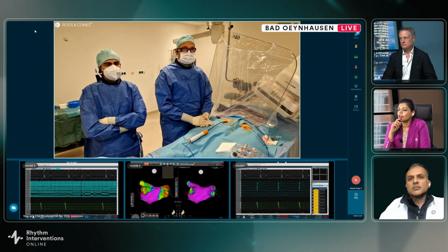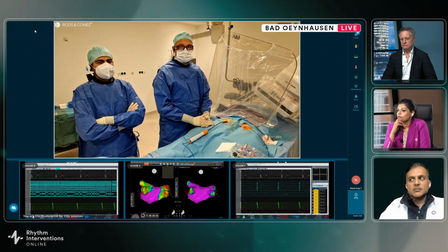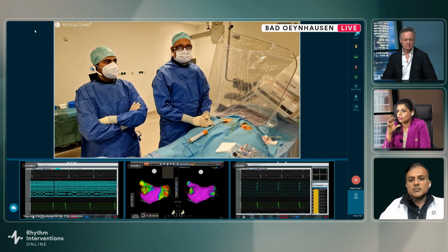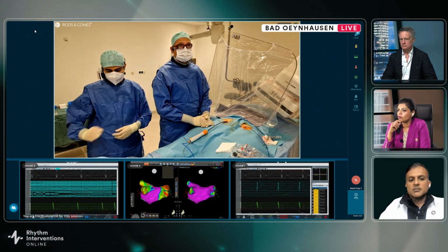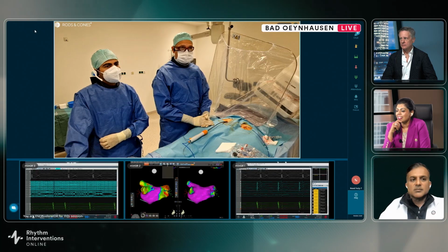ICE is more for keeping up with any safety concerns, keeping up with maneuverability, etc. But having said that, I absolutely love the TPI aspect of it, so I don't have to keep verifying and moving the ICE all the time. But I still use ICE in the LA. It's a habit.